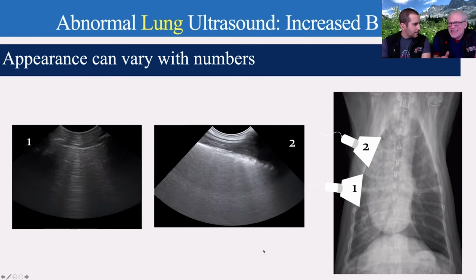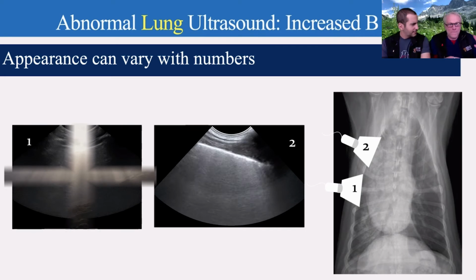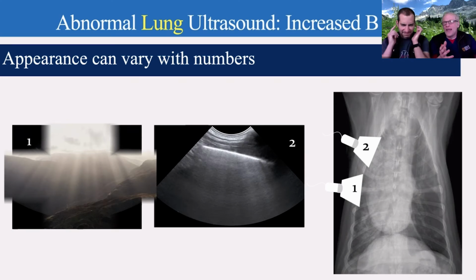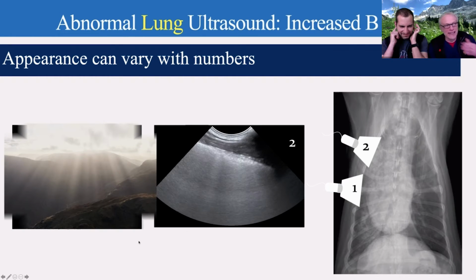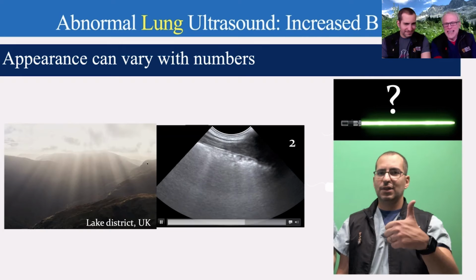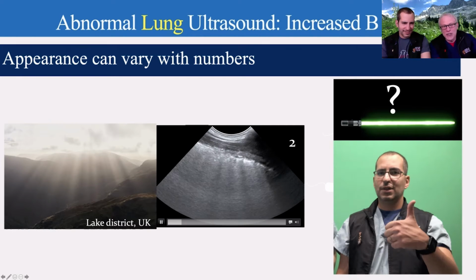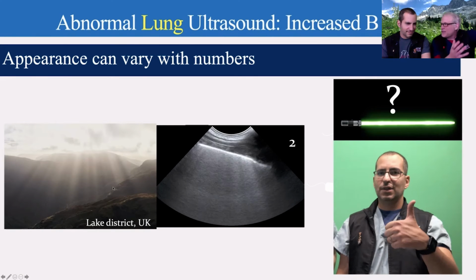Okay. And now, as I said, they look like lightsabers, Dr. Chalhoub. These are rays of sunshine from the heavens through the clouds. And I was hiking with a buddy of mine down Lewis in the Lake District. He's like, wow, that's a nice sunset there, Dr. Chalhoub. I'm like, holy frick, those are B lines. I need that image. Come on. Lightsaber? Like, yeah, I'm glad you agree with me. Finally, Dr. Chalhoub, thumbs up. This, look at it. Look how similar that pattern is. And now everywhere you go walking in the backcountry, when you see those rays of sunshine from the heavens, Dr. Chalhoub, through the clouds, you'll think, B lines.